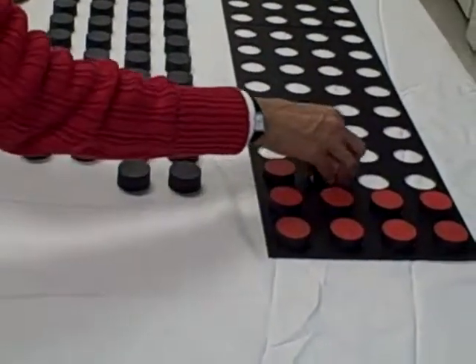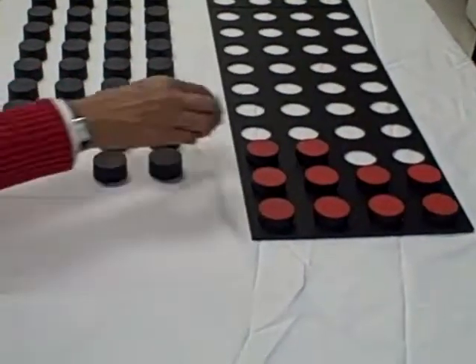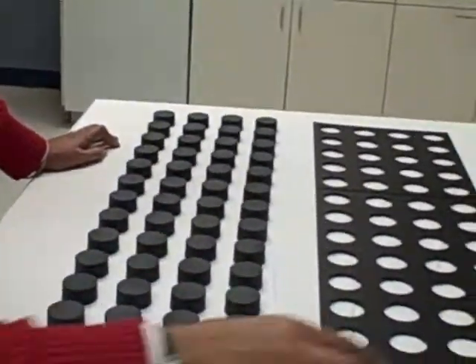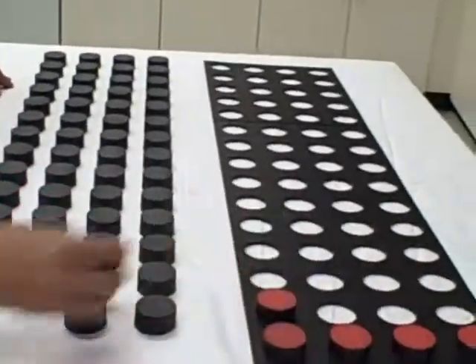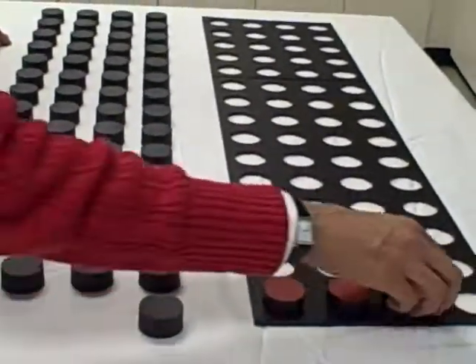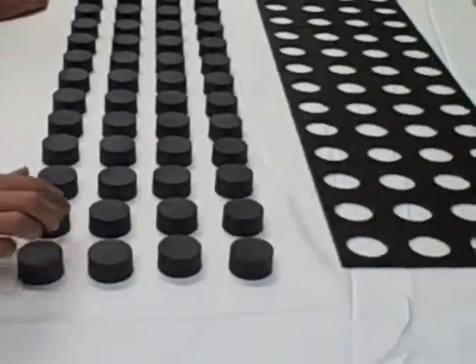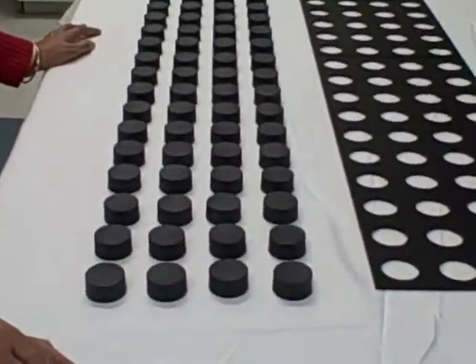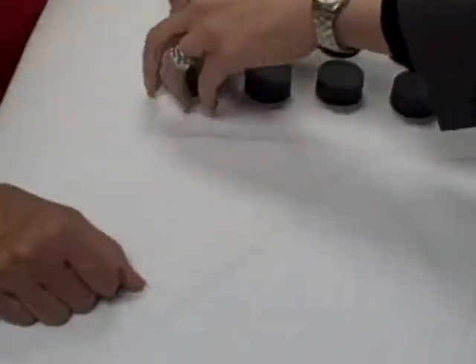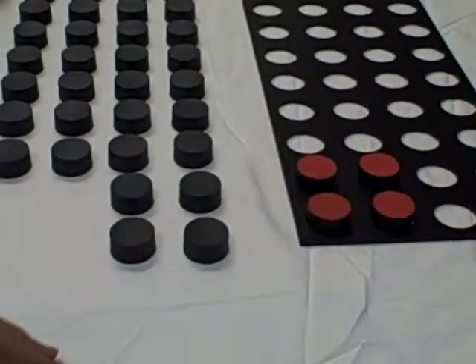And then the last one is called the two-handed turning and placing test. So it starts in the same position here with your tray separate. And the object of this test is to see how fast you can put the blocks back in the holes, bottom side up, two at a time, using both hands. So what you'll do, again, start with this one? You'll start with this, so you'll pick two at a time. And put them in like that.